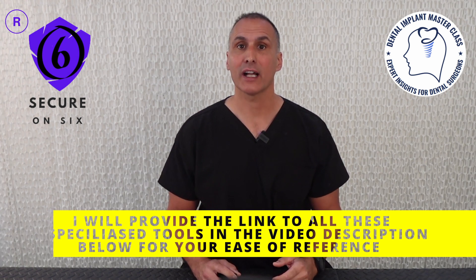I also checked the acrylic around the female equator implant abutments for optimal thickness and strength, as well as marginal finish of the acrylic so that it provided optimal contour.